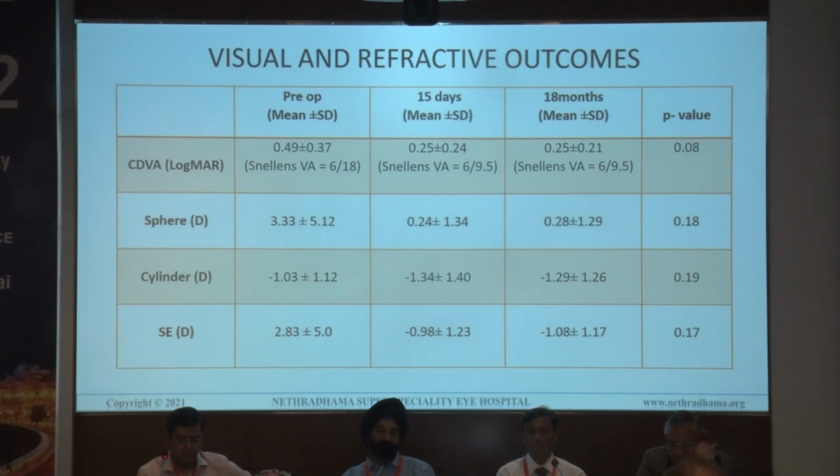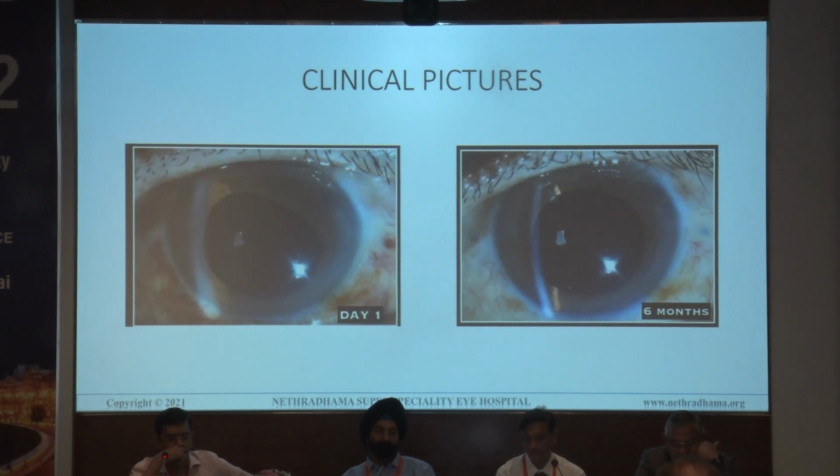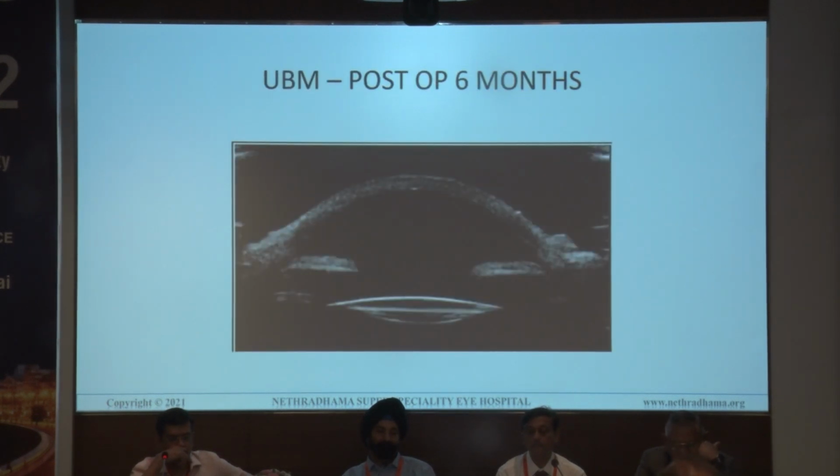Now coming to the results. When we compare the 15 days and the 18 months CDVA, sphere, cylinder and the spherical equivalent, it is not clinically significant, showing that the procedure is stable from the initial and the stability is maintained throughout. And the mean IOP on day 1 was a bit on the lower side, around 12, and on the 15 days and 18 months it was normal. And these are the clinical pictures showing the stability of the IOL, where we can see the flanges also well centered 180 degrees apart. And this is the UBM post-op 6 months picture, which is showing the well centered IOL.